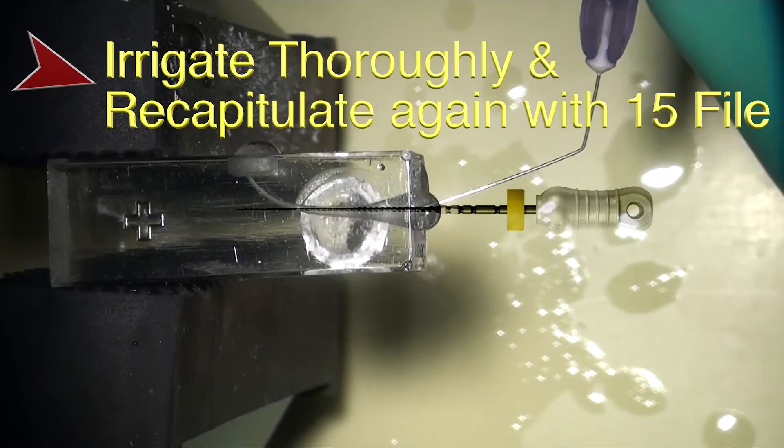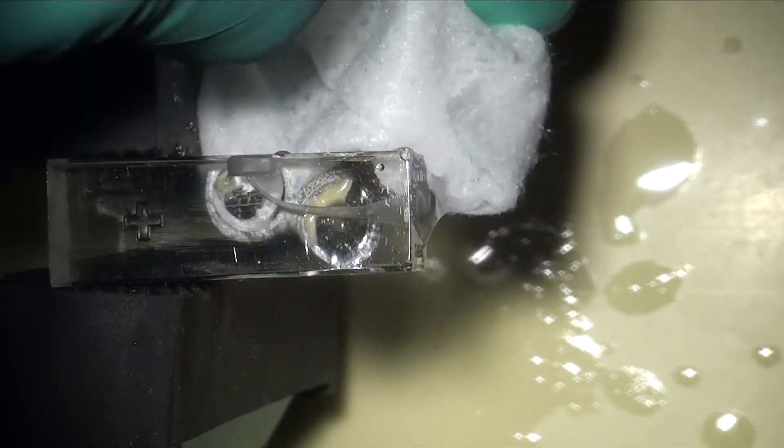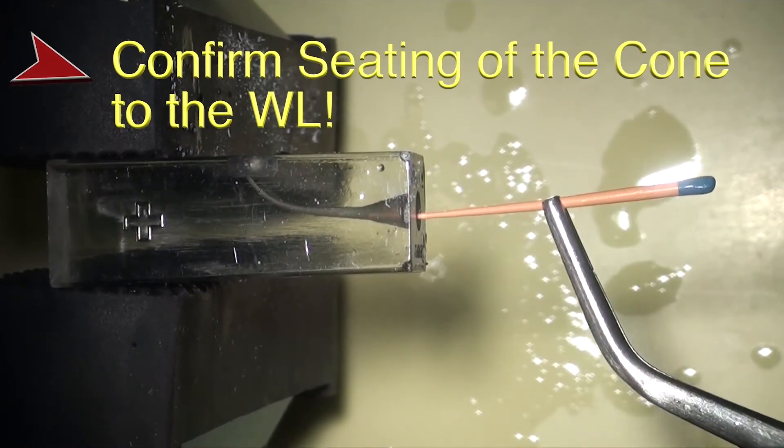Once you're done shaping, you should follow your irrigation protocol, and of course we would suggest the use of the finisher, which is discussed in other tutorials. But it's not necessary that you use these two instruments together.